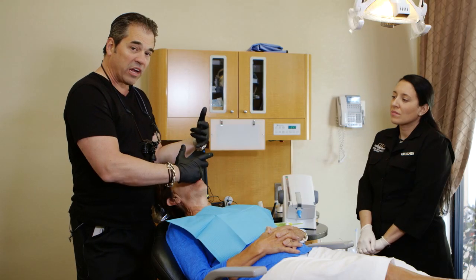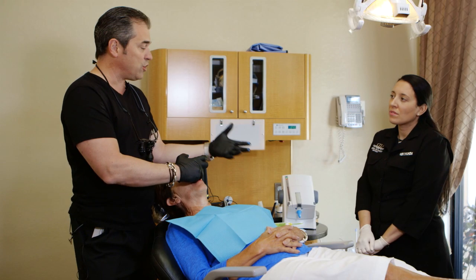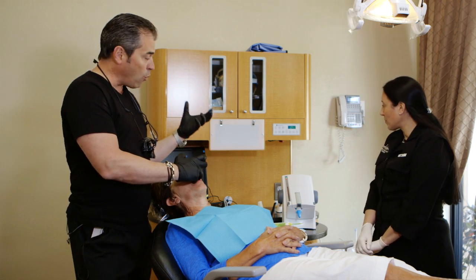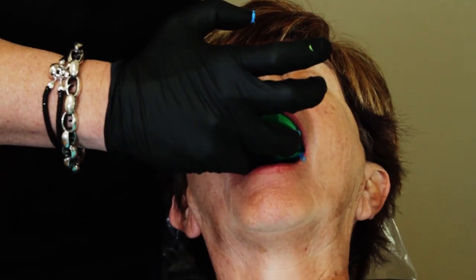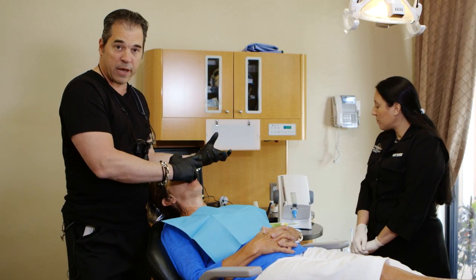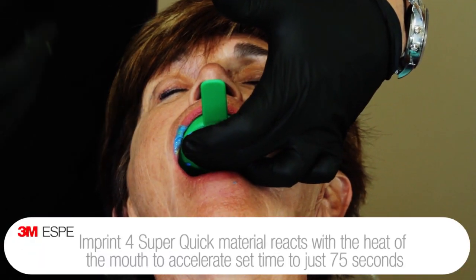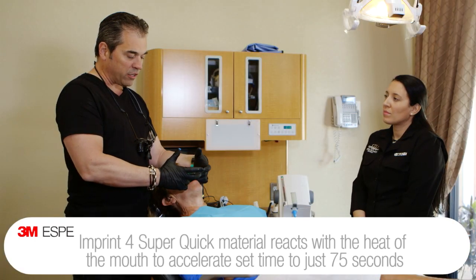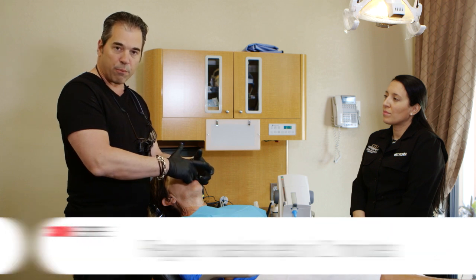So again, we're using the regular set here. I'm not in a rush. As you can see, we had a lot of working time, and that's big within the material. Dentists wanted a lot of working time, but once we got into the mouth, we were able to go ahead and get more of a quicker snap set. But now this material is reacting with the heat of her mouth, and once it reacts with the heat of the mouth, we'll be able to pull this out momentarily and have a really nice, accurate impression.